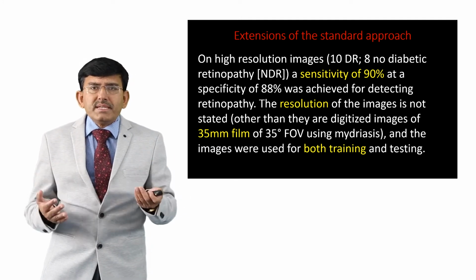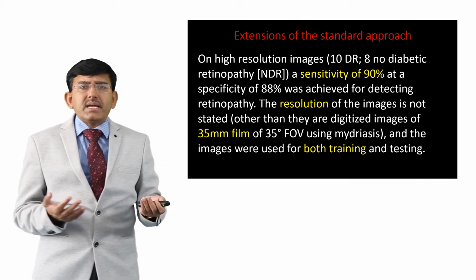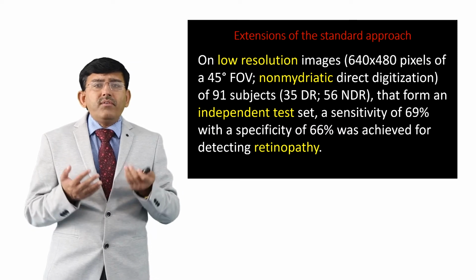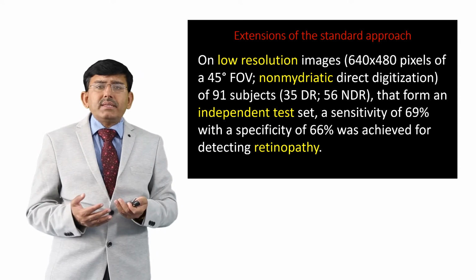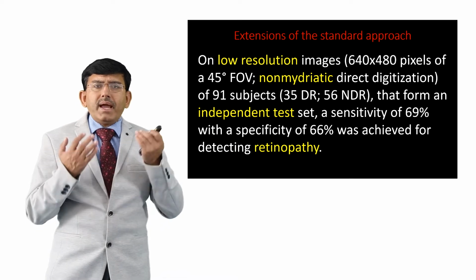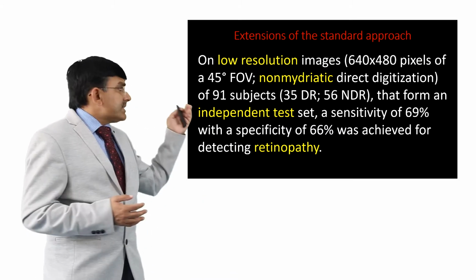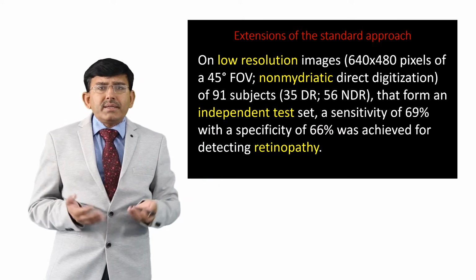On low resolution images of size 640 by 480 pixels of 45-degree field of view, non-mydriatic direct digitization of 91 subjects with 35 diabetic retinopathy, 56 non-diabetic retinopathy that form an independent test set, a sensitivity of 69% with a specificity of 66% was achieved for detecting retinopathy.